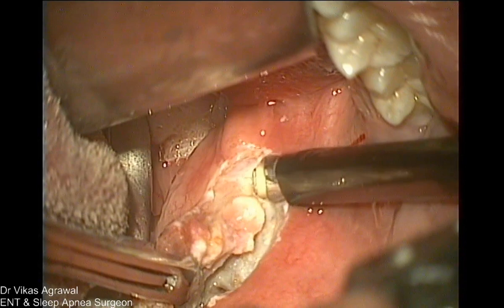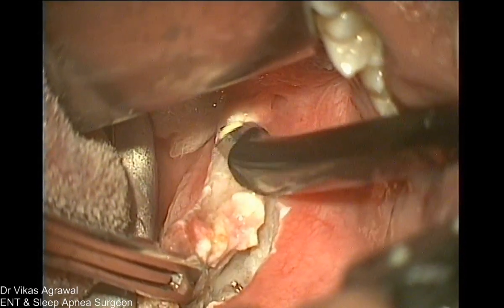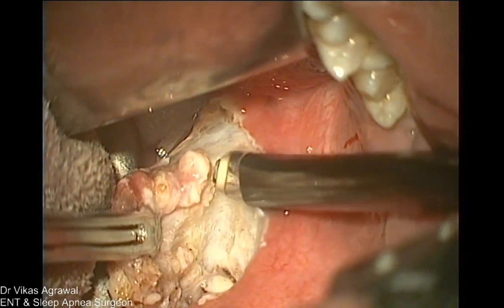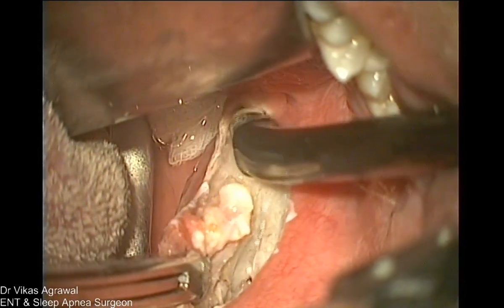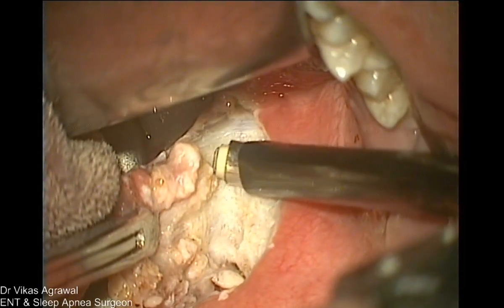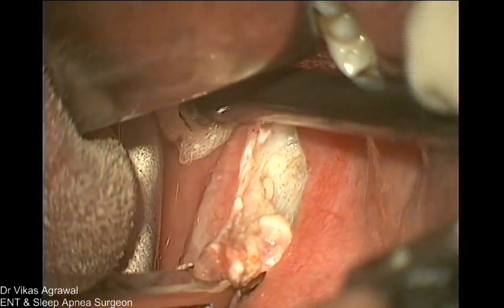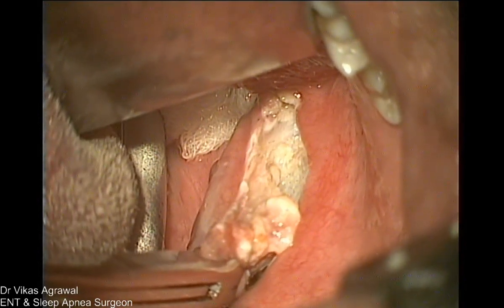See what I did on the other side accidentally. See, I hit the tonsillar artery only accidentally, because there was some movement here and I couldn't control. So you have to be really careful. So if that happens, you know what to do. That's why live surgery workshops are there, so that in real life situations, whatever you face, you still have to tackle it. Now this is the lower pole of the tonsil, correct? So here I expect the tonsillar artery somewhere here. So I'll be, sister, don't move at all. ठीक है, कोई movement मत करिएगा.